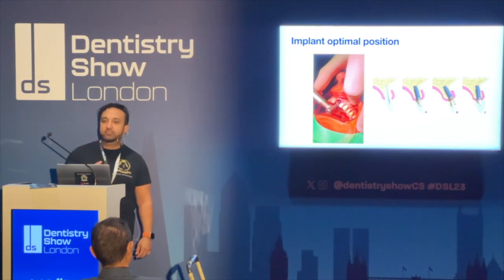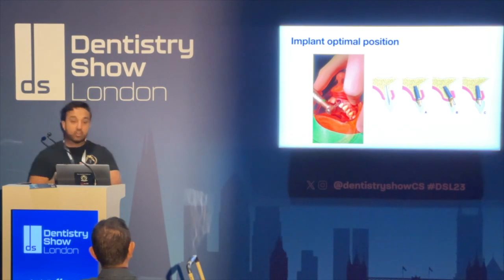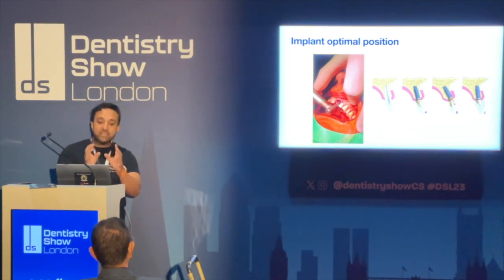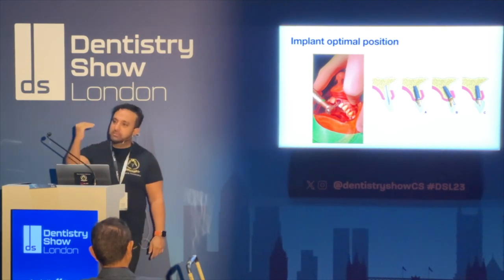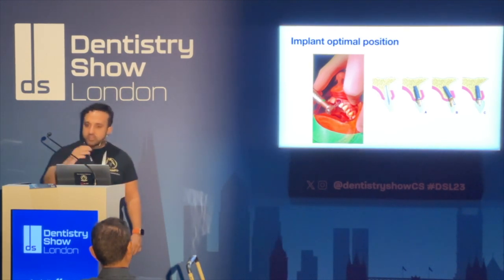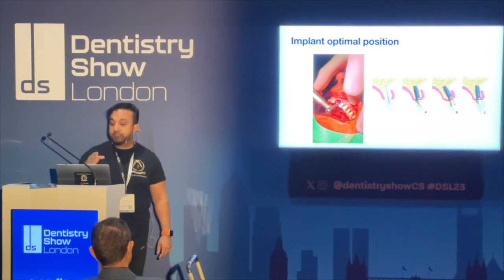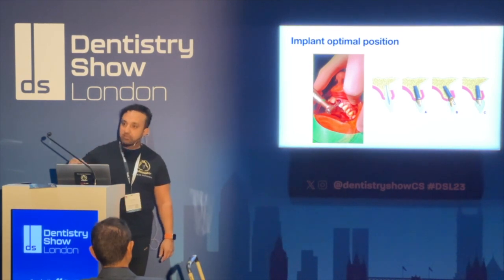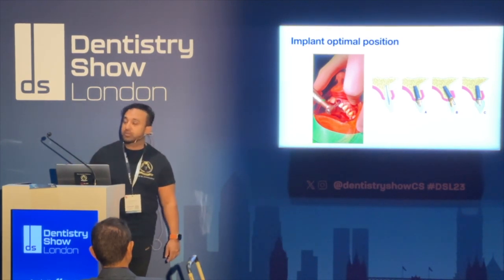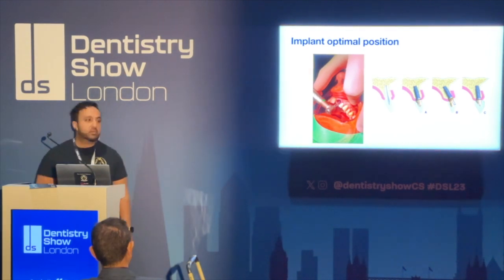And that will save that patient soft tissue grafting, hard tissue grafting, a lot of time, effort, because as we know, when we take a front tooth out, within 6 months they're losing 3 millimeters of bone. They lose the buccal plate. Doing this technique, replacing the implant, it was a fractured front tooth on a young gentleman, and we graft that area around the implant and put a temporary crown on straight away. Keep it off the occlusion. It's amazing technology we're able to do.